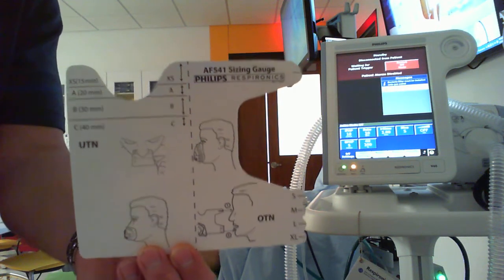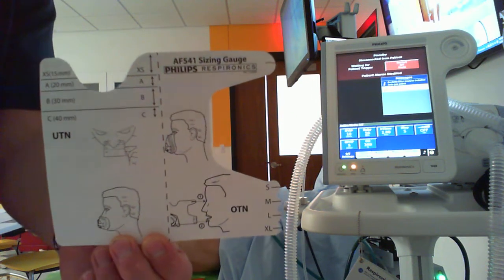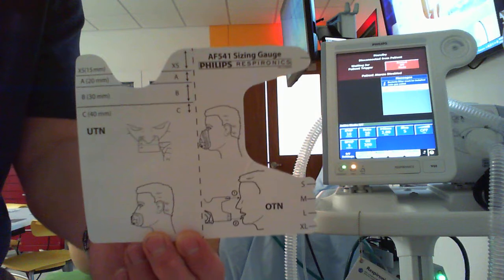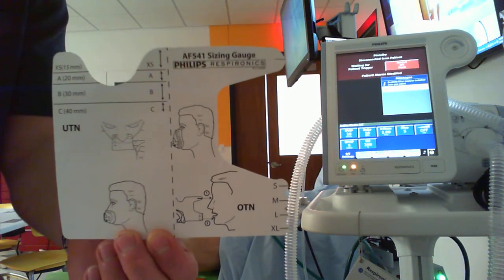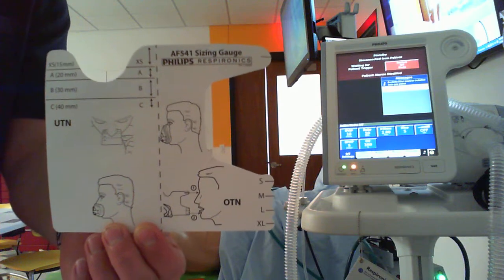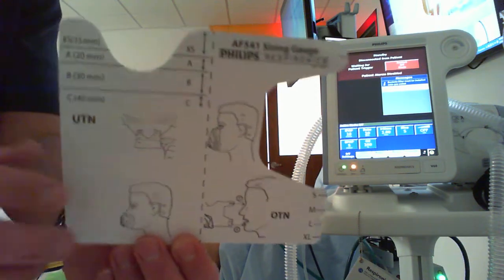So if you've got a patient with tissue breakdown, or having some pressure injuries from maybe having to wear this too long or having very, very thin skin, you can switch using the same headgear. You can switch over to an oral nasal mask, so it still covers nose and mouth, except it doesn't put that pressure on the bridge of the nose, which is the most common site for breakdown.